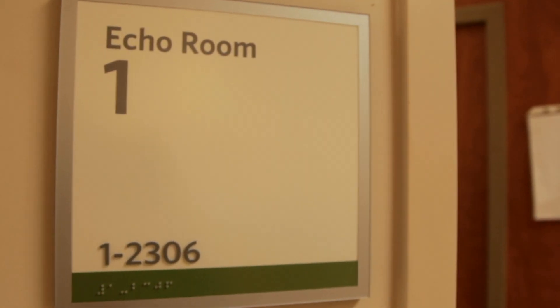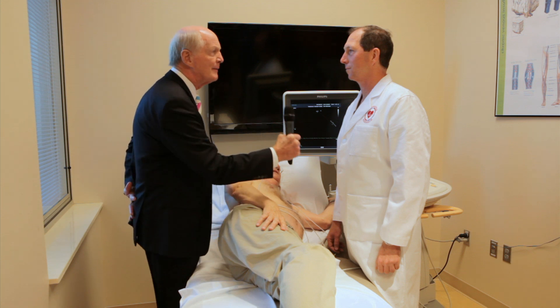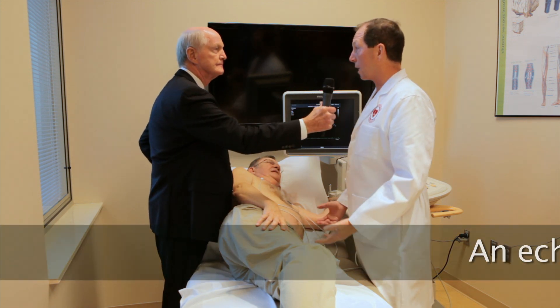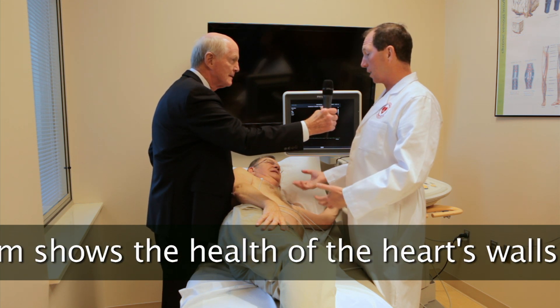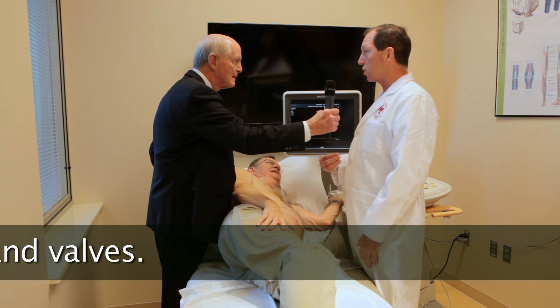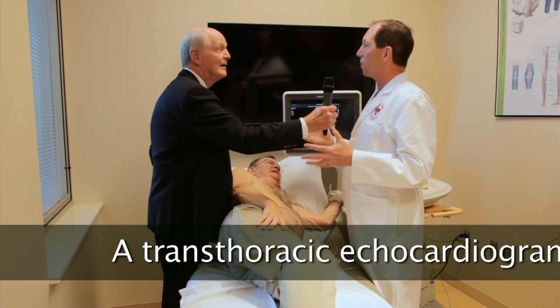We're here with Malcolm Foster in the echocardiogram lab. Malcolm, tell me about the echocardiogram — what do we see here? Well, this is a very common procedure. It's an ultrasound test. The person comes in, they lie on their side, and we take an ultrasound transducer on the chest wall. It sends sound waves through the heart, and we make images.